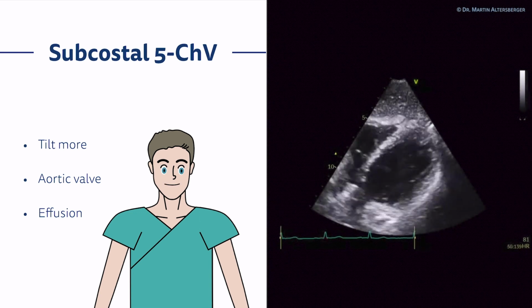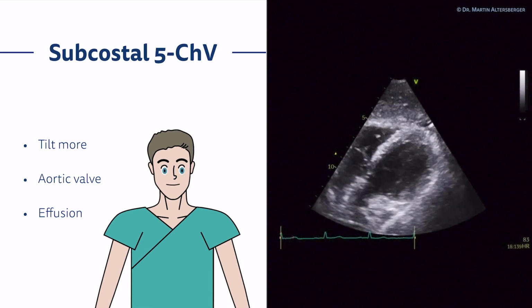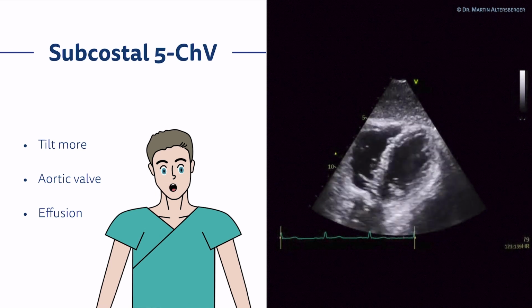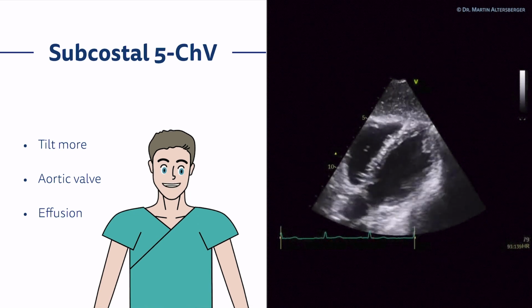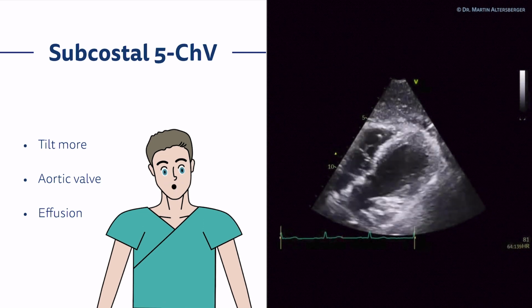Also in this case, you can take a look if there's pericardial effusion present, and you might think that here is a bit of free fluid. Overall, in this case, it's definitely not pathological. So also in this view, you can evaluate the heart if there is a relevant pericardial effusion present.